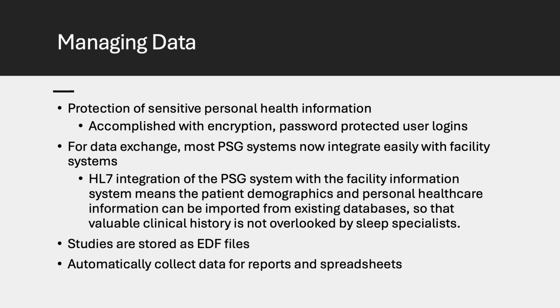conditions. PSG systems will export study files in EDF, which is similar to PDF, and other file formats so that patient records can be viewed across all sorts of platforms. Modern PSG systems will also integrate with spreadsheets and word processing programs so that you can just generate a report, and it can be tailored to show data in every way imaginable.